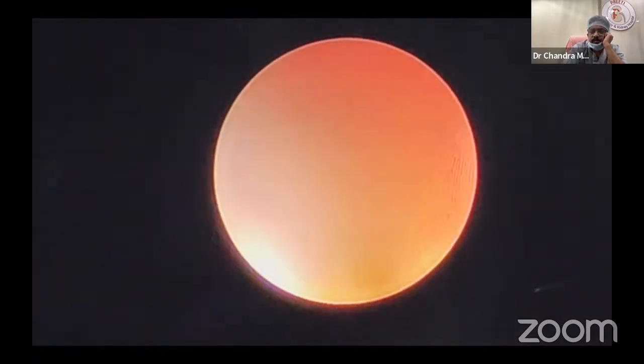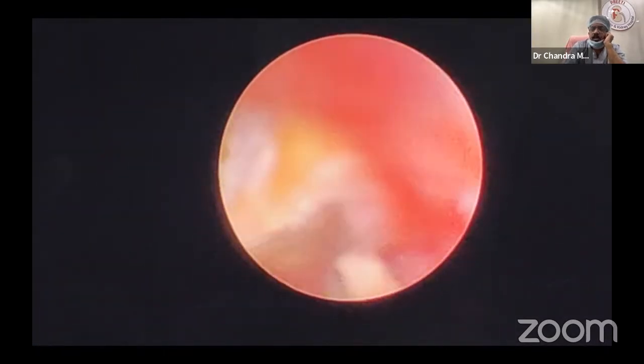See, all the impacted stone. Here is another point: the tip of the pneumatic lithotripter is much bigger than the laser, but stable, whereas the laser fiber is much smaller, so you can touch, but it is unstable. Advantage, disadvantage. If I use the laser fiber, it will touch nicely, but the problem is it will wobble and touch here and there.